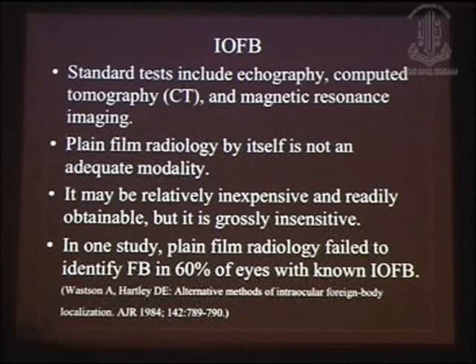In case of intraocular foreign body, the standard tests include echography, computed tomography, magnetic resonance imaging. The plain film radiography by itself is not an adequate modality, but it may be relatively inexpensive and readily obtainable, but it is grossly insensitive. In one study done by Watson A. et al., the plain film radiography failed to identify the foreign body in 60% of the eyes with intraocular foreign body.